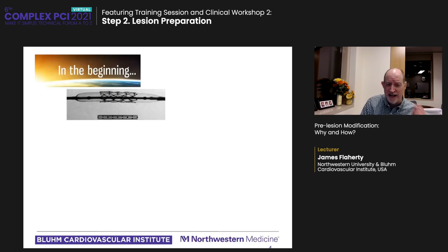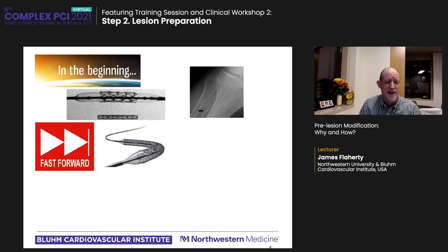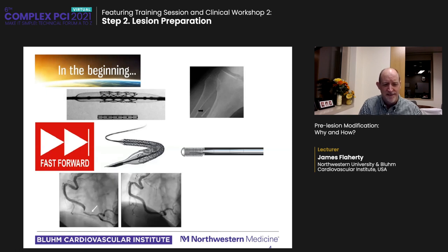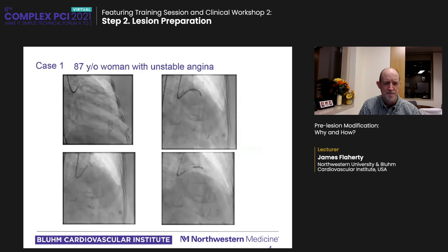In the beginning, the stents were hand crimped and they can fall off and go embolize distal and some other limb. But now we've got very thin strut, flexible stents. We've got nice new sophisticated supportive wires. Here's an example of a lesion untreatable 10, 15 years ago, but now with tools like guide extension catheters, stent delivery has gotten much easier. I'm going to show a couple of cases of the importance of lesion modification.